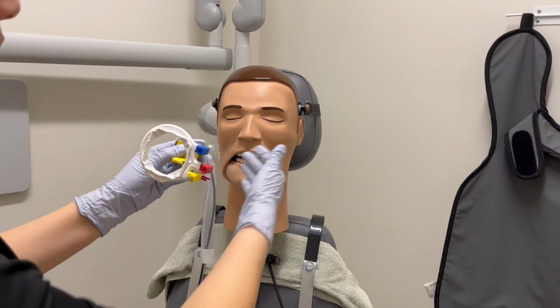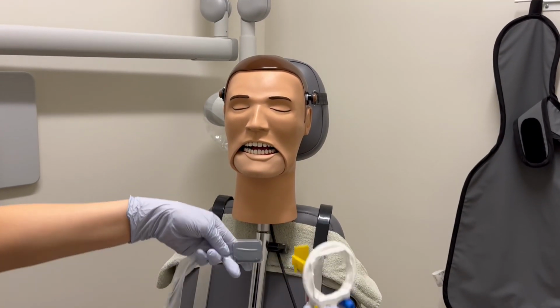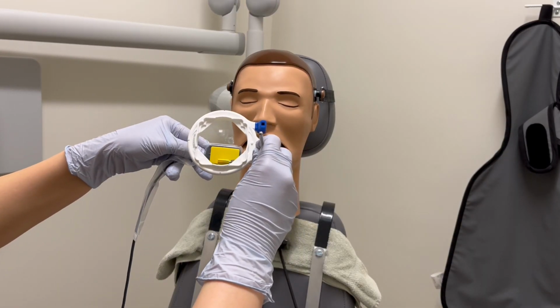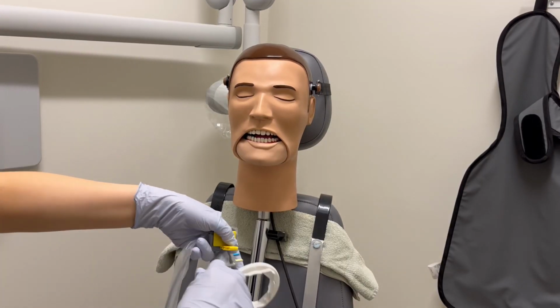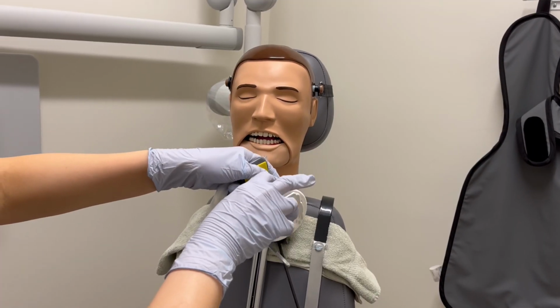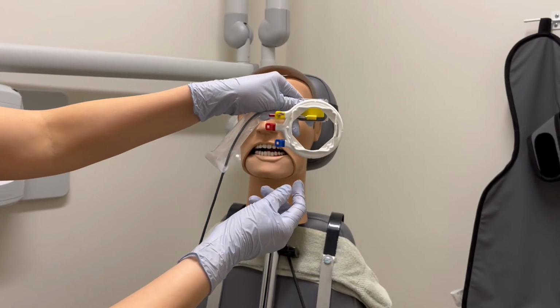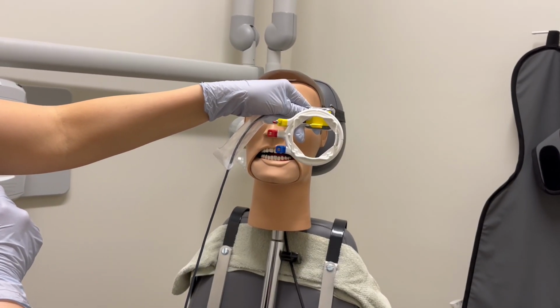As we move up to the maxillary arch, upper left, we will need to change the orientation of the bite block because the cord needs to be sticking out of the patient's mouth. Switch the orientation of the bite block. And then also the yellow prong has to be on the left side of the bite block. Then we're going to flip this because right now the sensor is not smacked in the center of the plastic ring.